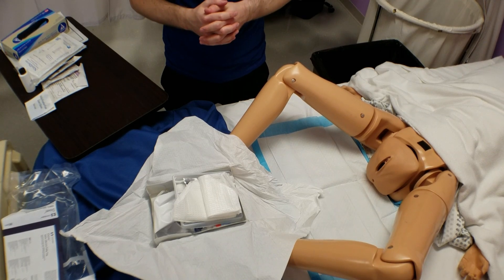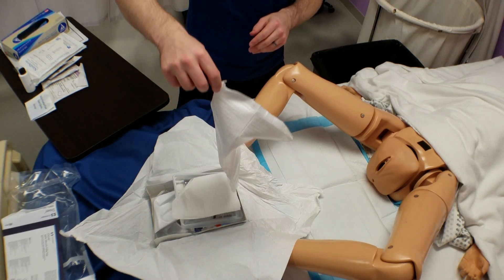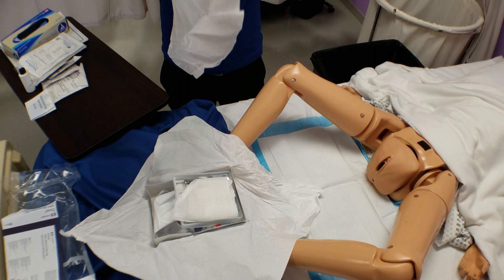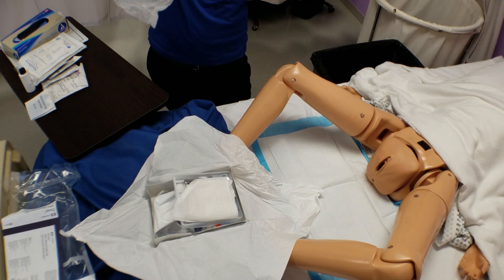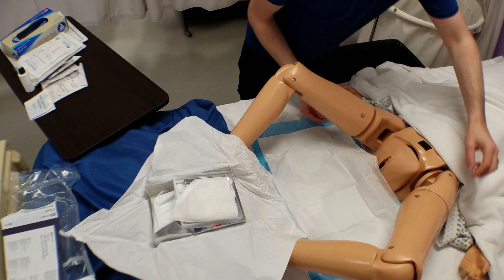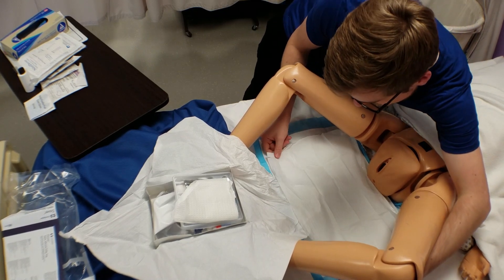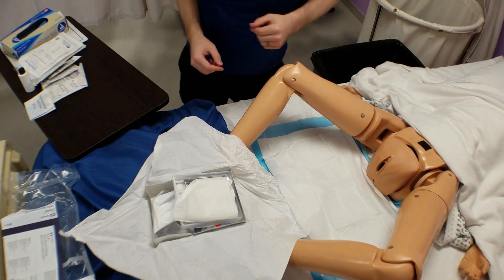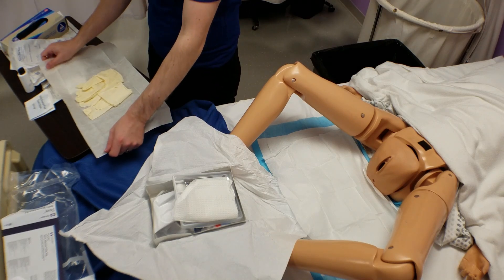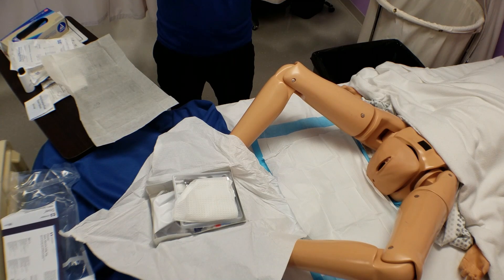Remove the square sterile drape from the kit. With clean hands, carefully grab the drape by the folded edge and lift upward. Separate the drape by only touching the edges, then place the drape shiny side down under the patient's buttocks. Alternatively, you may apply sterile gloves brought separately from the kit, take the drape while wearing the gloves, and place it under the patient's buttocks while preventing contamination. If you placed the square drape with clean hands, you should now apply your sterile gloves from the kit or separate packaging, and be sure not to turn your back on the sterile products and drape.